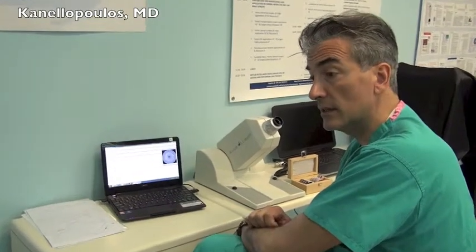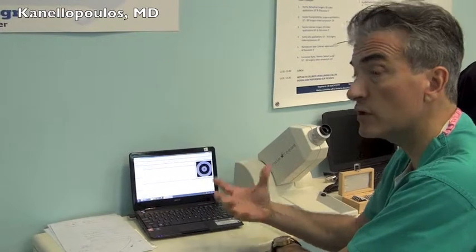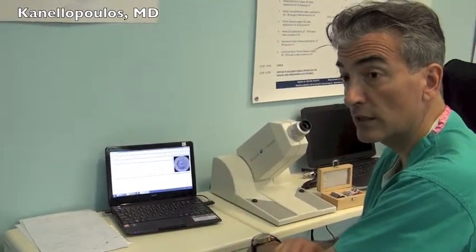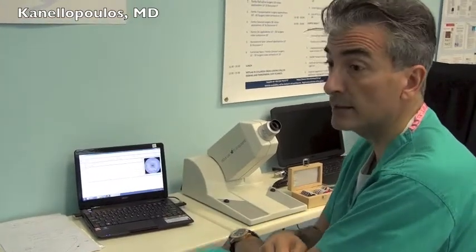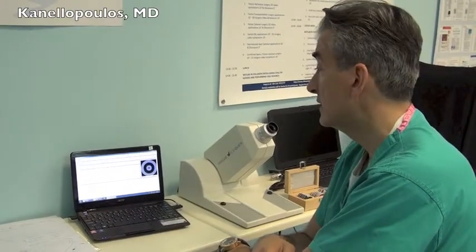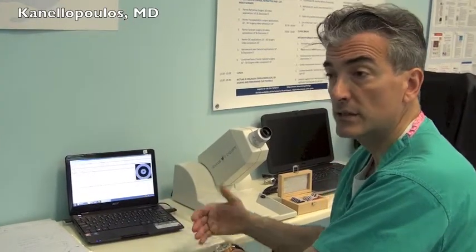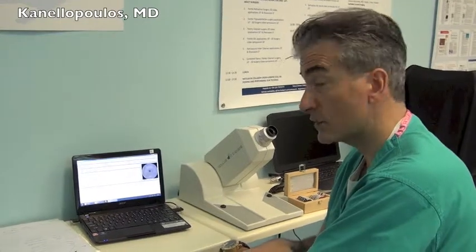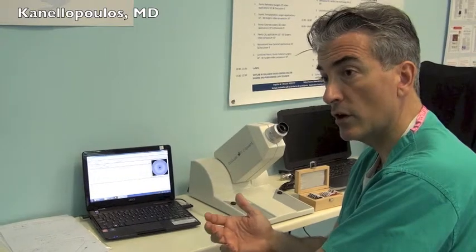The other patients that we're studying this in, which is very interesting, are the pre-cataract age patients, where we can actually see a more sophisticated method of measuring visual function. We're accustomed to measuring Snellen acuity, and unfortunately Snellen acuity is still used by the FAA and international authorities as the way commercial pilots are measured. In our opinion, this is a much more sophisticated test, besides visual acuity and contrast sensitivity, to measure the degradation of visual function that depends on ocular scatter.